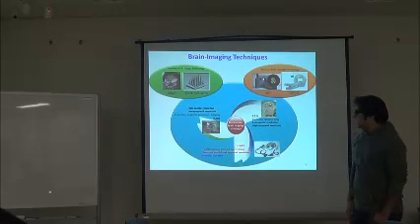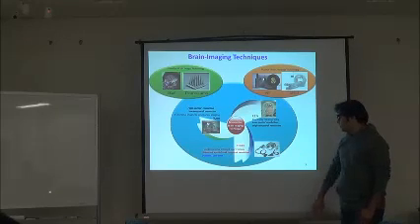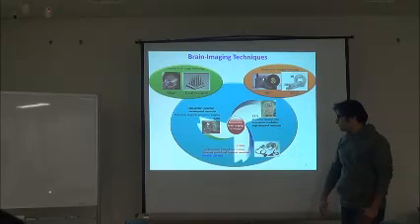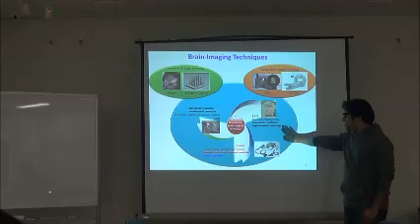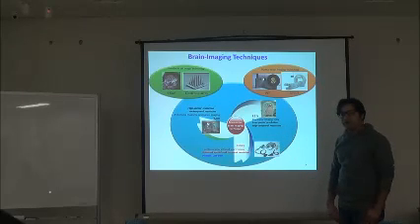Out of these three, fMRI is usually very bulky, while EEG and fNIRS are portable and low cost as well. So potentially for brain-computer interfaces, we are left with two imaging modalities, EEG and fNIRS. Out of these two, the EEG signal is very noisy.